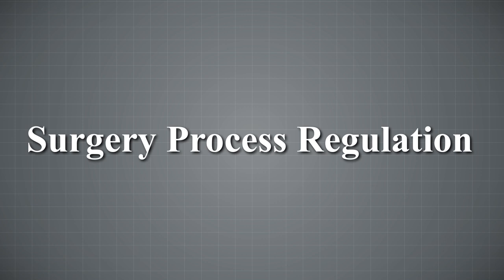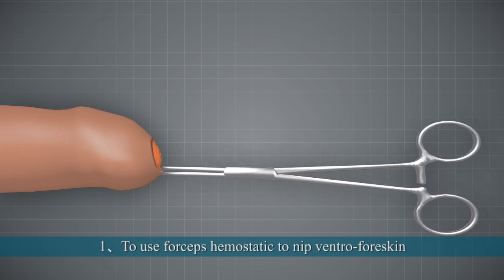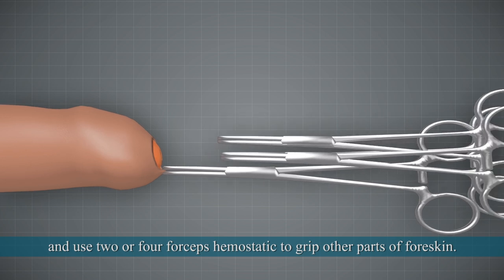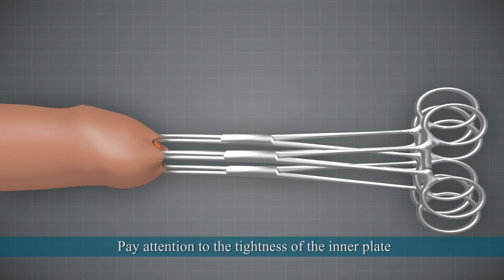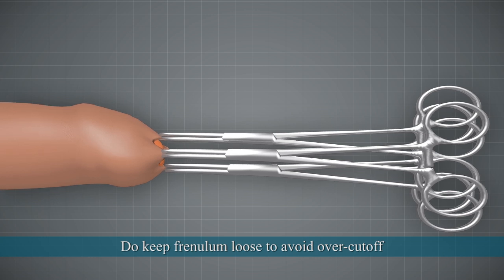Surgery Process: 1. Use hemostatic forceps to clamp the ventral foreskin. 2. Use 2 or 4 hemostatic forceps to grip other parts of the foreskin. 3. Pay attention to the tightness of the inner plate — keep the frenulum loose to avoid overcutting.